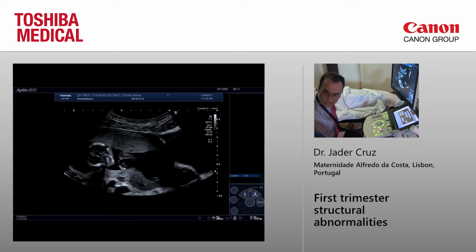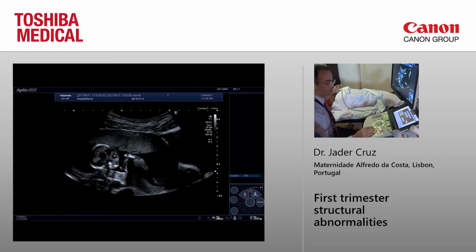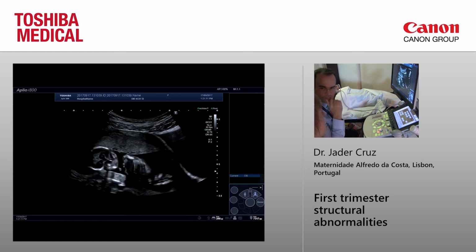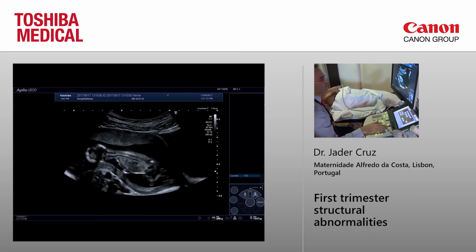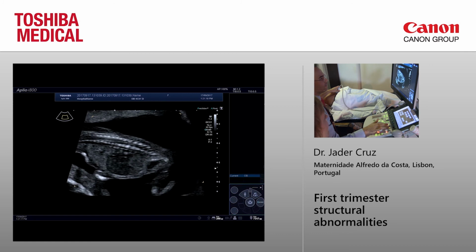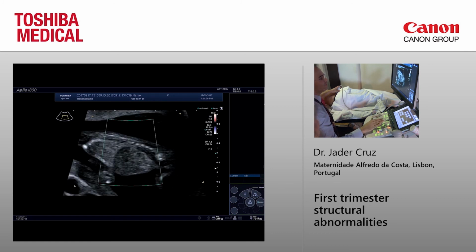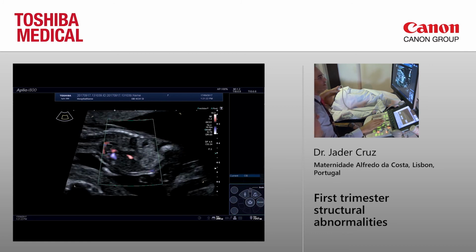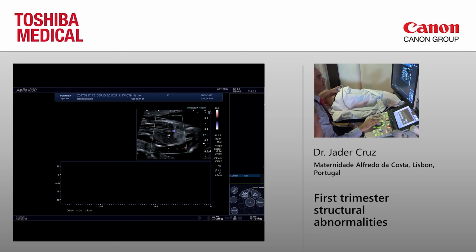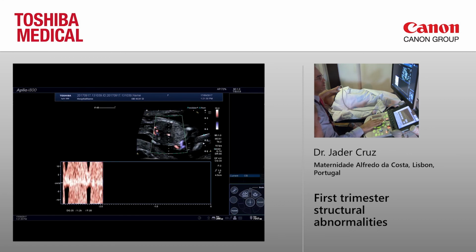You're doing a brilliant job, but would you be able to show us ductus venosus and tricuspid regurgitation, please? Ductus venosus and tricuspid regurgitation. Okay. I hope I can show you tricuspid regurgitation. But the ductus venosus, yes. There you have. Yes, ductus venosus. You have the aliasing there, and of course the baby is moving. And now I pressed the wrong button.